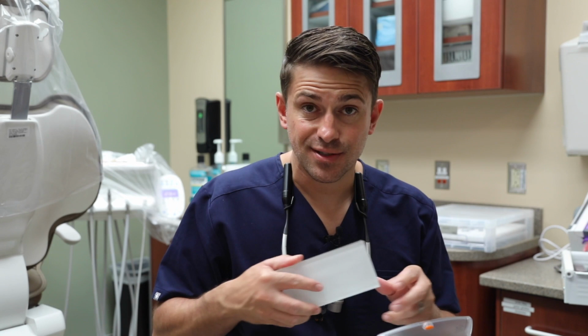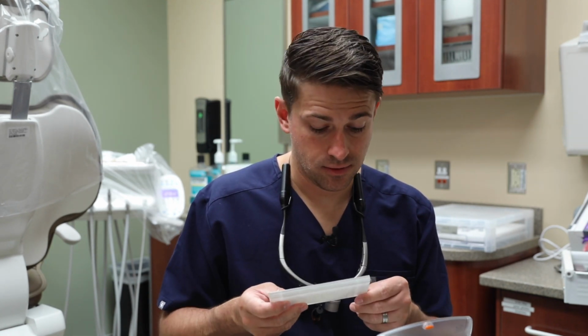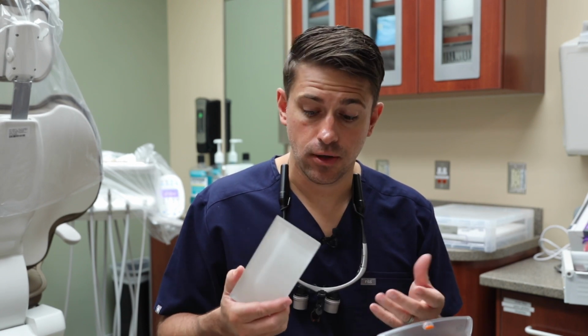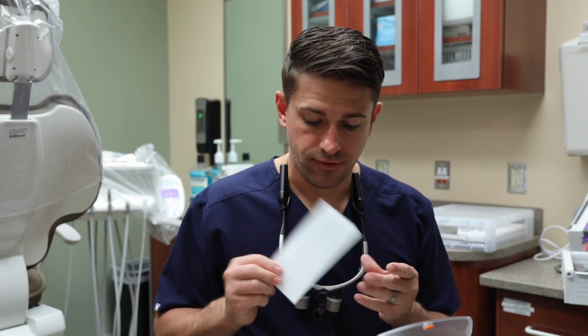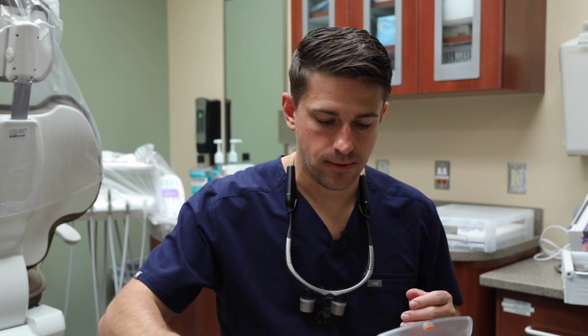Alternatively, I used this earlier. You may have noticed this. This is just a glass ceramic block or tile that you can get from Lowe's or Home Depot. This thing was 99 cents and it works great. I was trying to find a black one, but all I could find was this white, but it's a nice, clean surface that you can put your stains and glazes on.